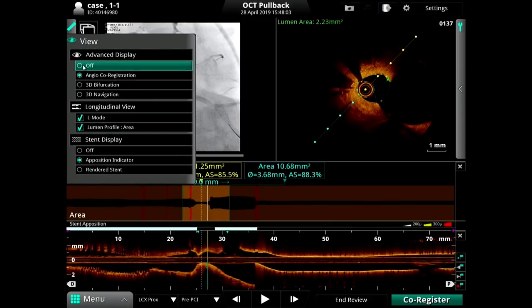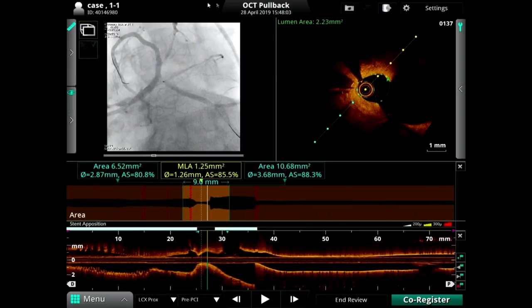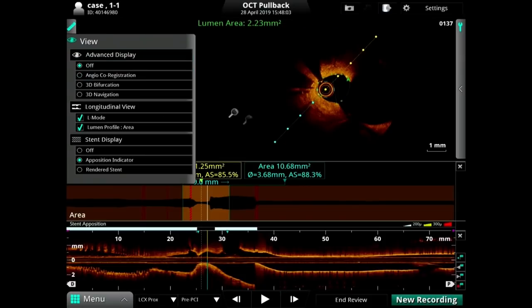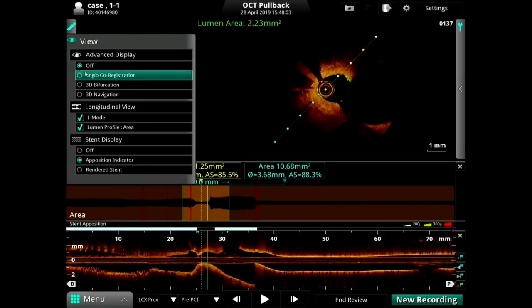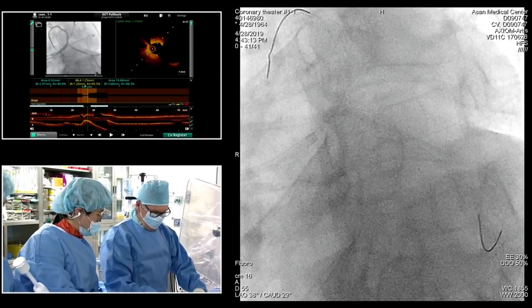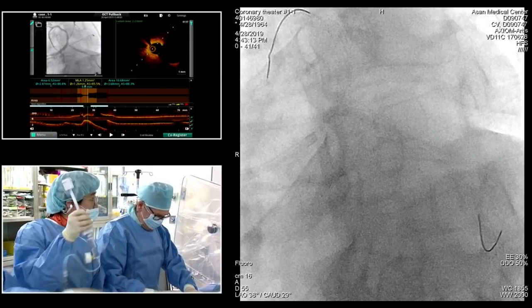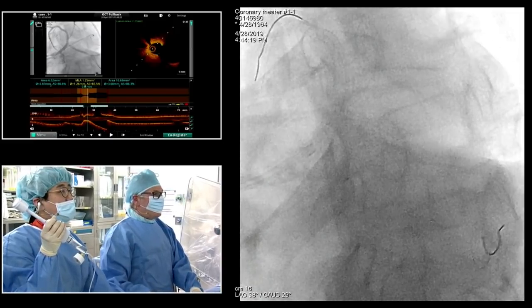That's the problem. For most classic crush, according to my personal experience, we have to completely crush the 3-layer strut. So from OCT, as Kiko said, the 3-layer struts separate from each other. It means there is a large gap between the first and second layers, so that would be a problem. It easily causes abnormal shear stress. So you're saying the crush was not complete at the time of the stent implantation. Yeah, that's what I want to say.